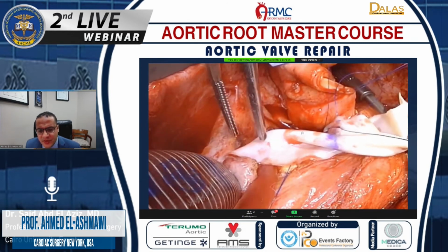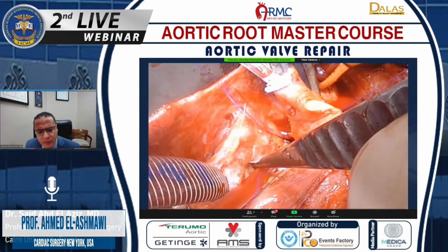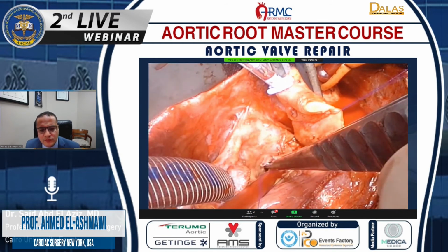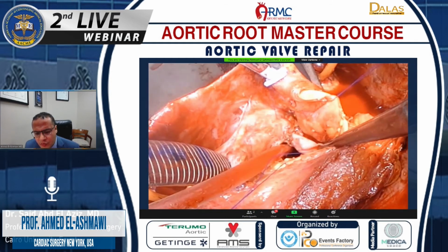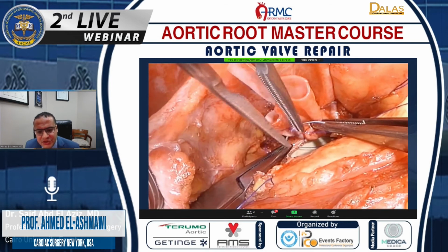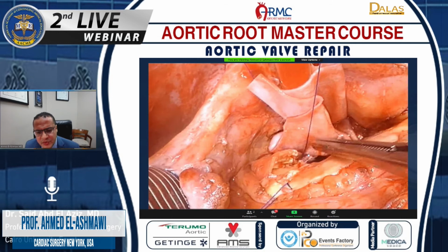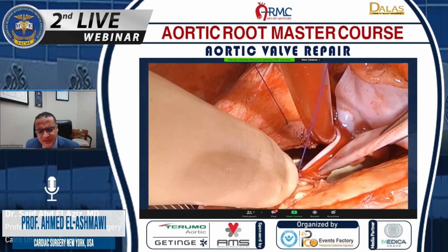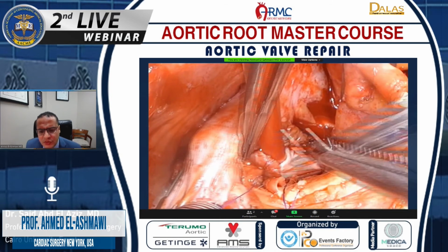The patch is lowered into position, and then we reconstruct the dome of the left atrium by running a 3-0 Prolene suture using SH needles backward. And then we reconstruct the curtain by suturing the anterior one-third of the cuff of the mitral prosthesis to the full thickness of the patch. And that will be our new curtain, basically. We go from the lateral commissure to the posterior commissure, and then the sutures are tied. We'll leave a vent through the dome of the left atrium at this point, and then we'll pay our attention to the aortic root.